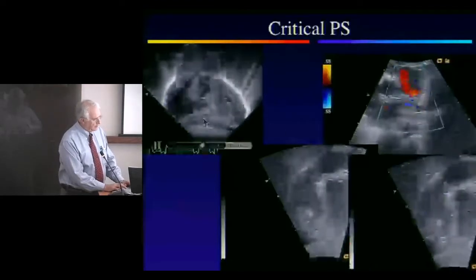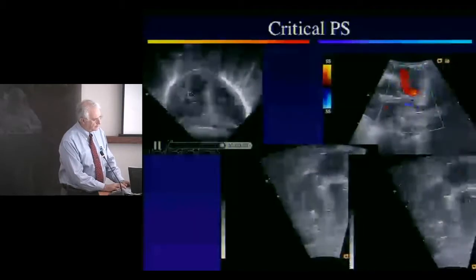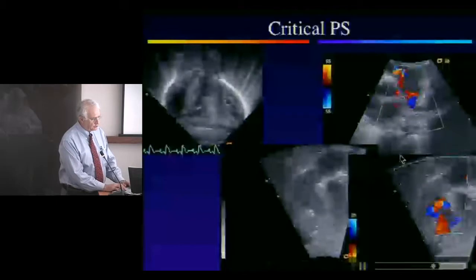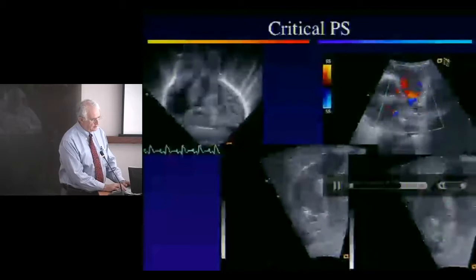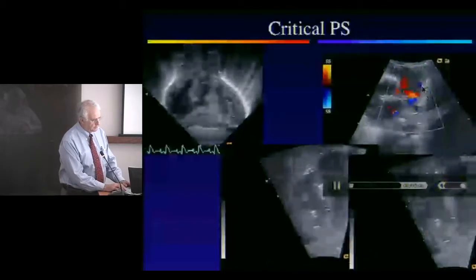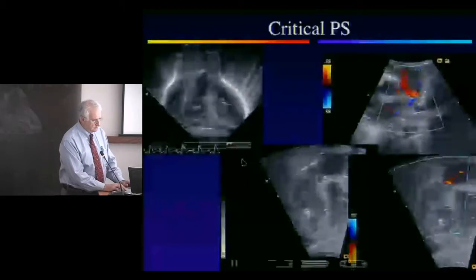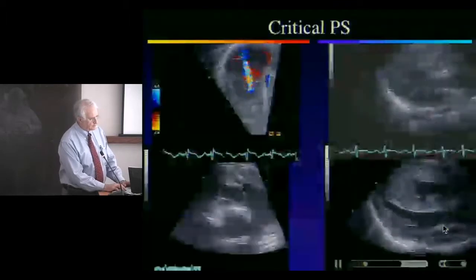There's marked right ventricular hypertrophy. The parietal band of the crista is hypertrophied. You can see there's increased coronary blood flow because you can see the coronary really well. The valve domes in the subcostal position, and there is both stenosis and insufficiency running in a very bizarre direction along the anterosuperior aspect of the valve, and then bouncing back off the valve. And these are the branch pulmonary arteries. And again, you notice the hypertrophy, the domed valve, and the increased size of the pulmonary artery here.